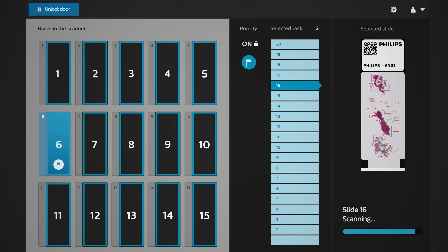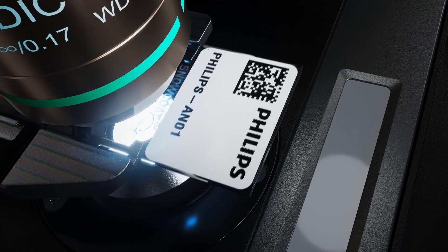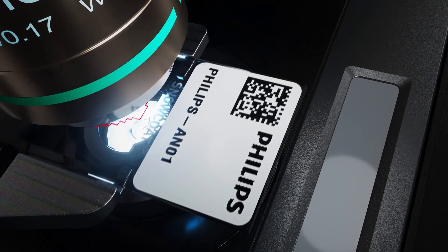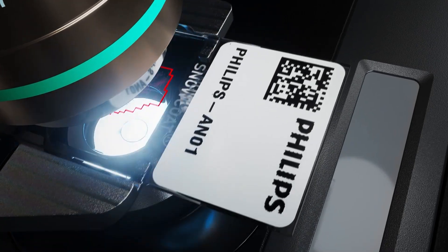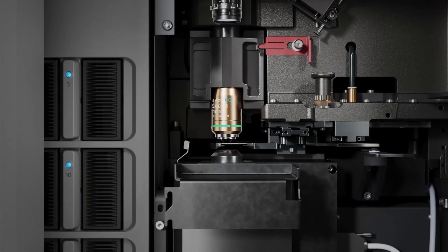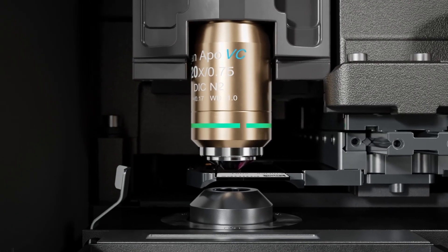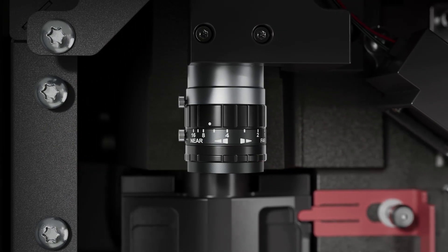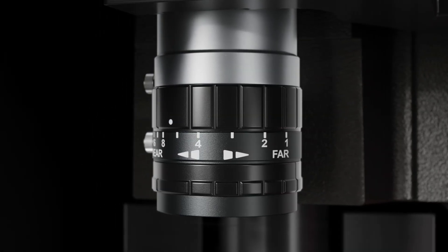The Pathology Scanner SG's optical system delivers continuous autofocus for precise, efficient scanning. It automatically adapts the scanned region to the shape of the tissue to reduce over-scanning and accelerate throughput. Pathology Scanner SG delivers consistent accuracy and image quality due to an optical system designed as a single optical path, resulting in stable and reliable image acquisition for enhanced diagnostic confidence.